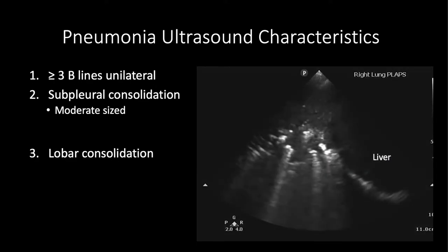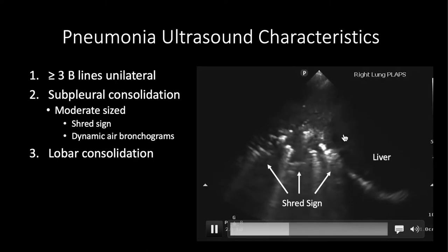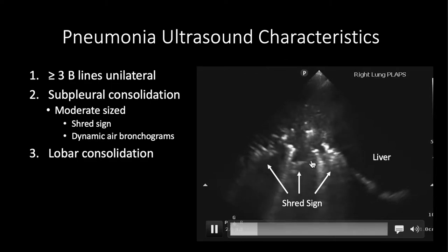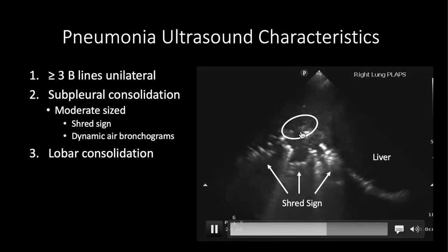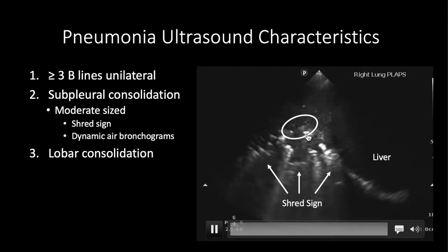Here's a larger subpleural consolidation where pus is increasing in the lung. You can see what's called a shred sign — an irregular border of the pleural consolidation, like the lung has been shredded because it's filled with pus. You also see dynamic air bronchograms: as the patient breathes in and out, you can see air movement in the lung as white hyperechoic spots that move with respiration. This further increases the likelihood you're looking at pneumonia.